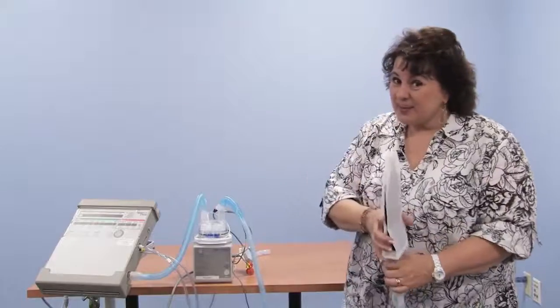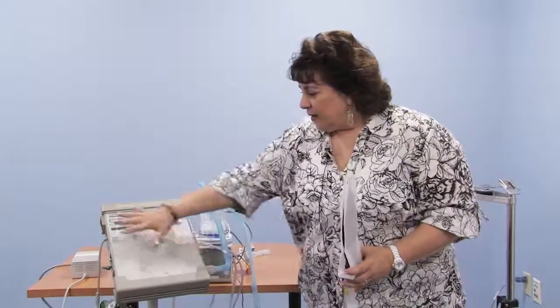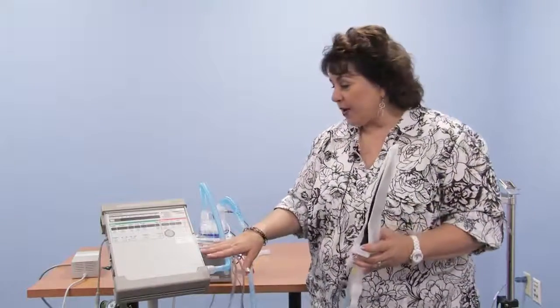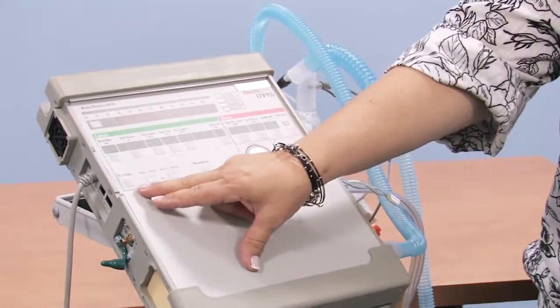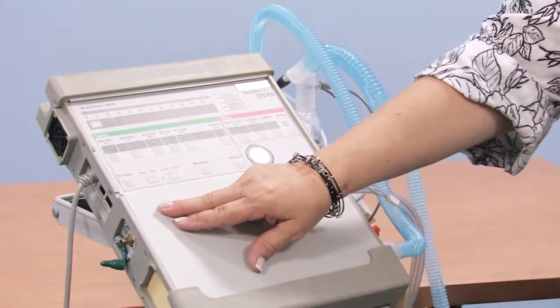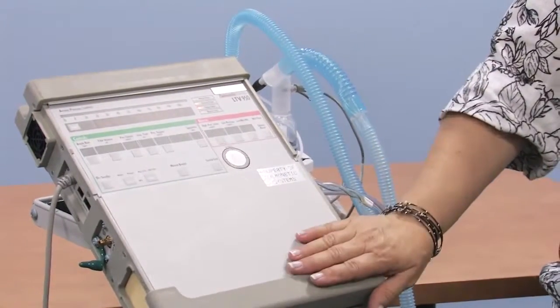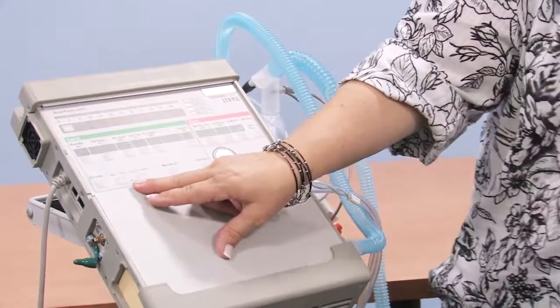It's time for us to look at some of the numbers and settings on the machine. This is the 950 as we've talked about, so the PEEP is set on the hose of this particular model. We have a power button here, on, off. On is one touch, off is hold for 3 or 4 seconds. It will alarm when you turn it off, and you need to silence the alarm to acknowledge that someone has turned off the machine. We have to pick our mode of ventilation.